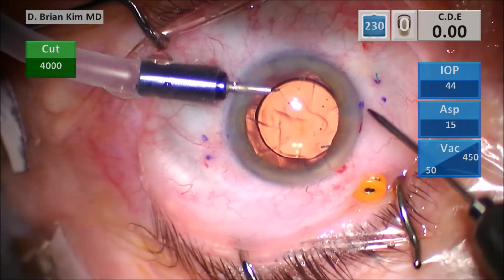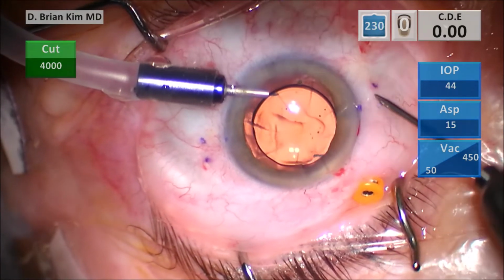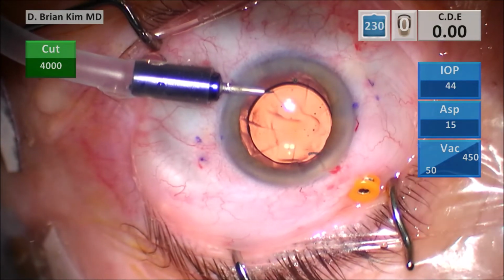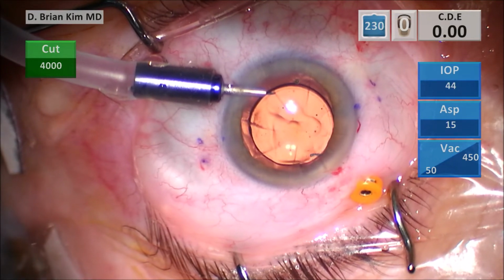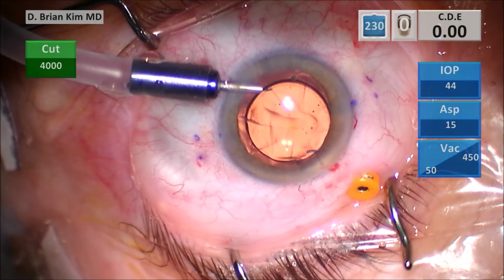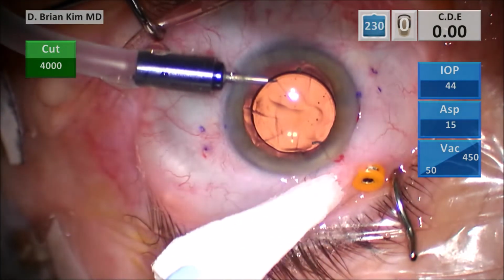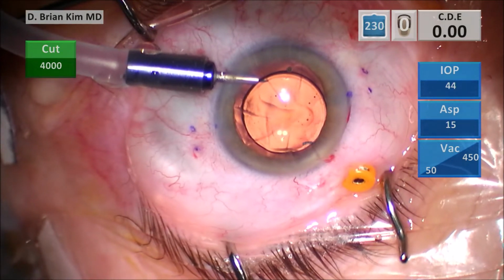But this is very important, and I've said this many times. Look how flat the haptics are on this case. When you have a flat haptic, that means you have a good scleral shelf support. The flagpole sign means the haptic is pointed towards the sky, which means you're going to have terrible lens position. The optic is going to sag, and more importantly, you'll have a terrible refractive result if you do it that way. So this is a perfectly centered lens in the posterior segment, just under iris plane.